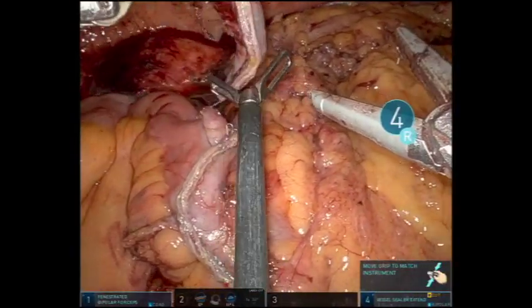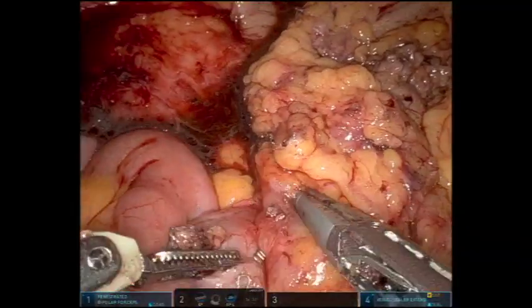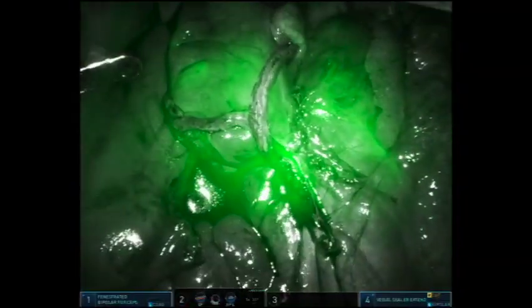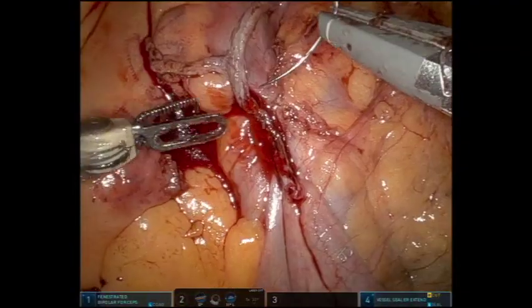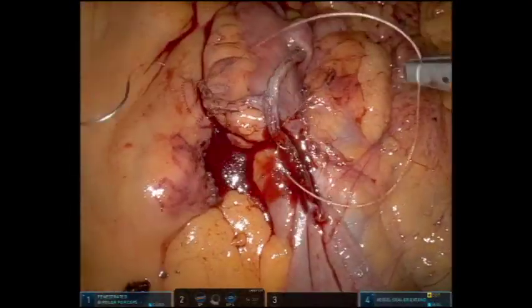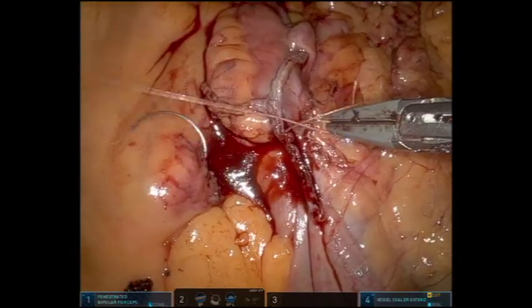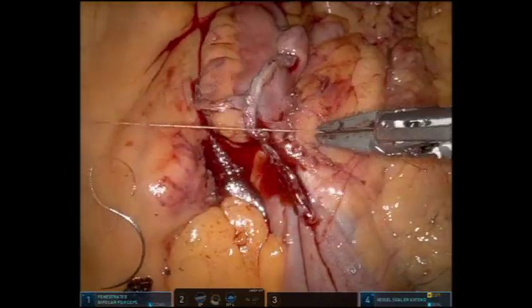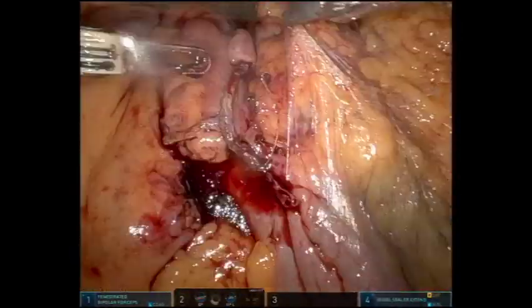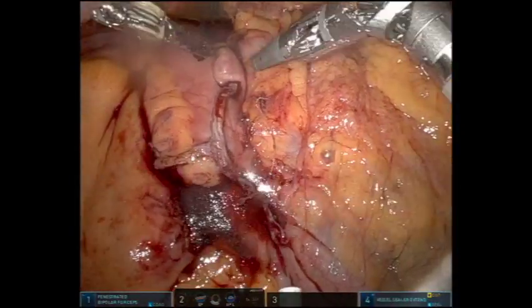The small anastomotic edge is removed from the abdomen. Fluorescence angiography is again utilized and the anastomosis is seen to be well vascularized without any defects. There was a small amount of bleeding from the final staple line that was fired, so figure-of-eight sutures are placed using absorbable suture. These sutures for hemostasis can be placed quite easily using the robotic platform. Fibrin glue is then placed over the staple lines.